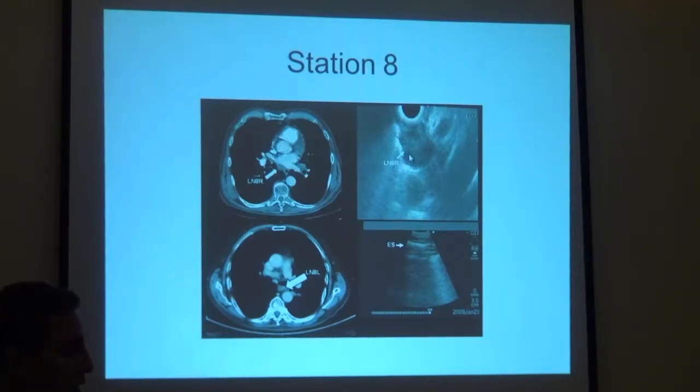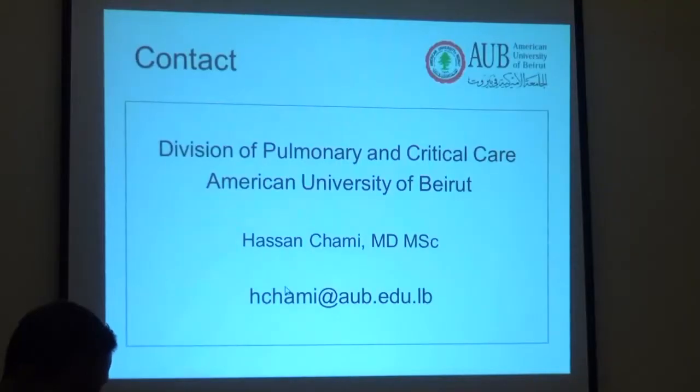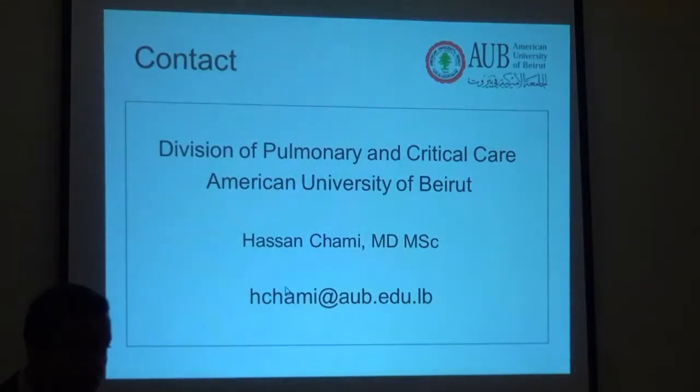Many times by mistake you find yourself in the esophagus. The patient coughs a lot. Sometimes the view is clear, everything is okay, but you can't see anything endoscopically. You just see ultrasound views. So you can get to it by EBUS, but you just need to go to the esophagus here, and that's what you're seeing. And with that, I'll stop and take questions.